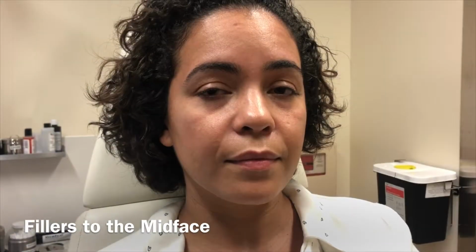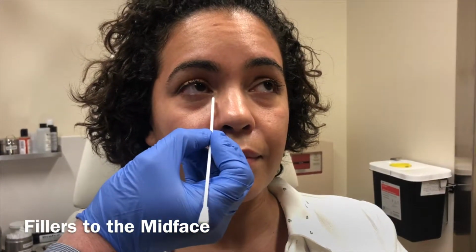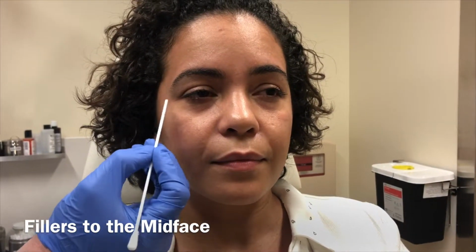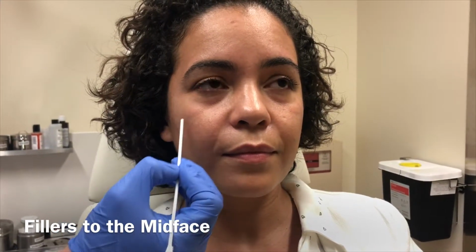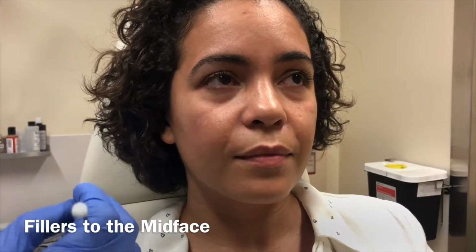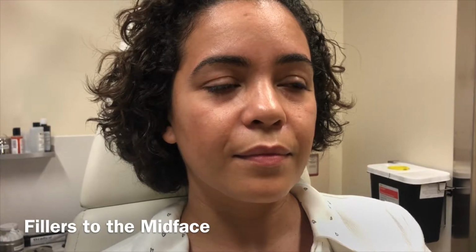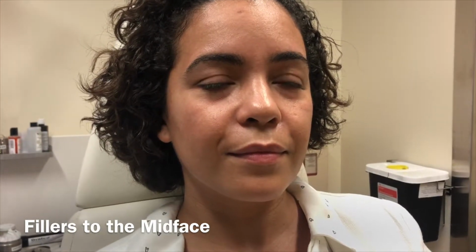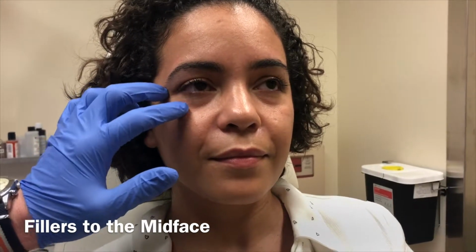Okay. And what I like to do is draw a line right here from this area called the tear trough right there, and then also from this area called the lateral canthus. And it kind of creates this sort of rectangular area right there, which really you get the most bang for your buck from any filler. And the filler we're going to use is called Voluma. It's a very dense, long-lasting, and very cross-linked hyaluronic acid filler that's going to last for a long time. So this will be a nice lift here.